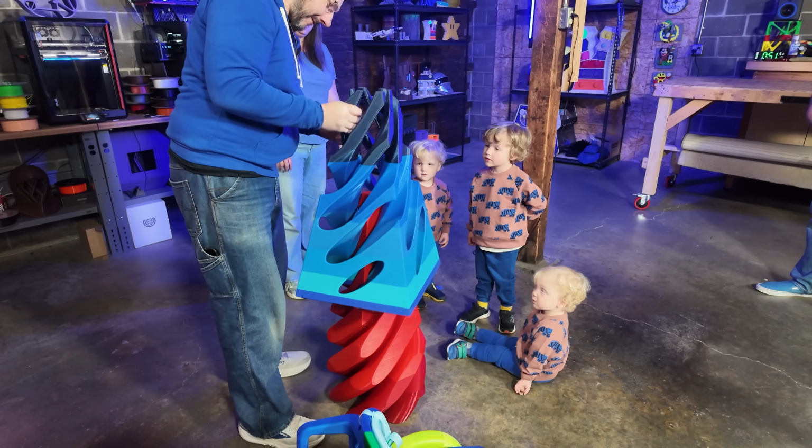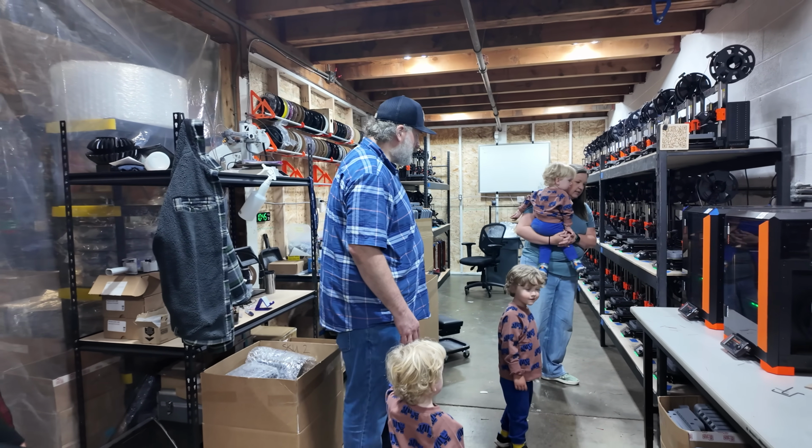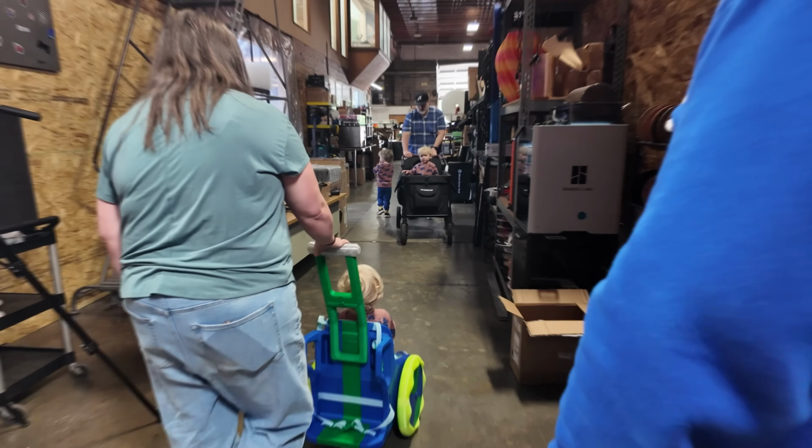The kids also saw things here in the studio, and I showed them the print farm, which they were really excited to see. The TMT, star of the show, Waylon, star of the show, and it went great. I'm so happy they were able to do that, and I'm so happy I was able to put together a TMT for Waylon.